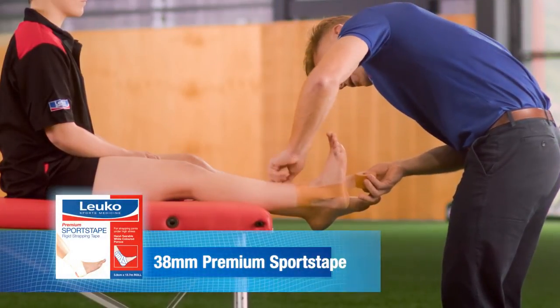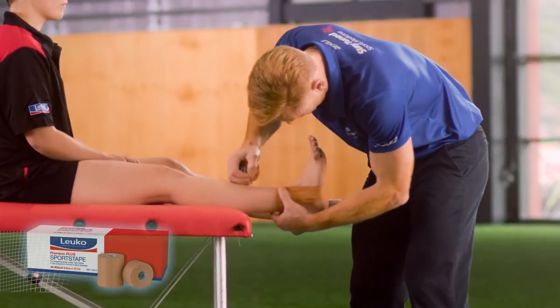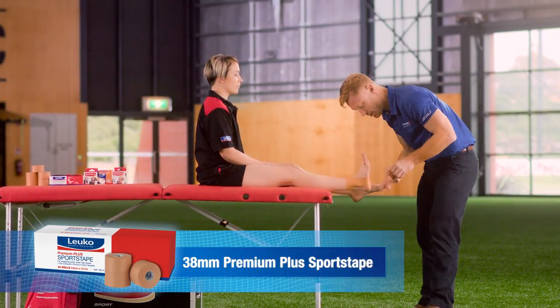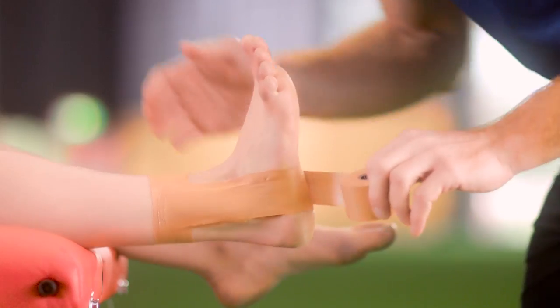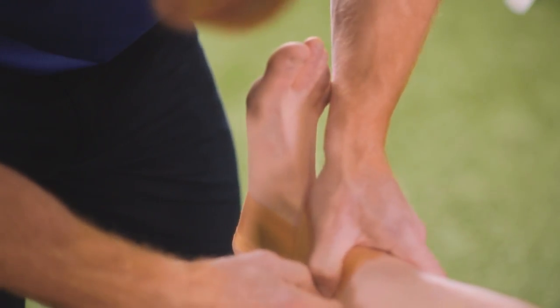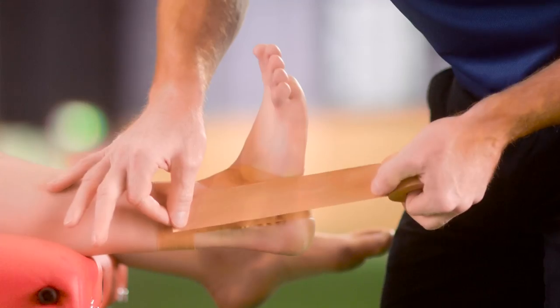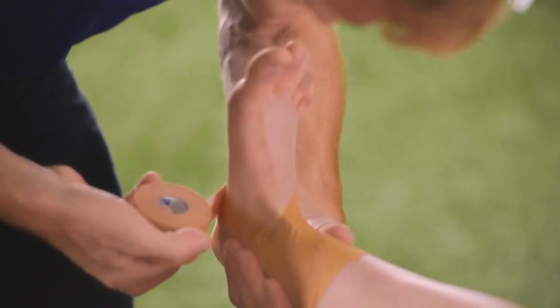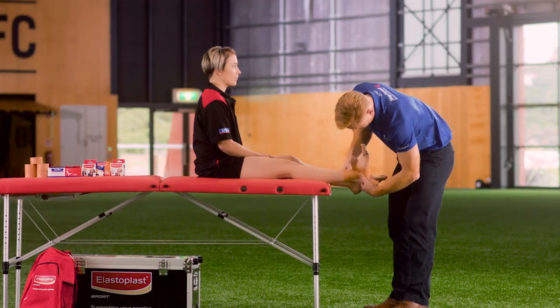We cover the previous tape by 25% to ensure adequate support. Following the application of our stirrups, we do a figure six. We start again on the medial side of the ankle or calf, go underneath the foot, come up and across the front anterior aspect of the ankle, finishing on the inside medial aspect of the calf. We can then repeat that on the lateral or outside of the ankle to add further support, come underneath the foot, and again come across the front of the ankle back to where we started, making sure we pad down on each application.